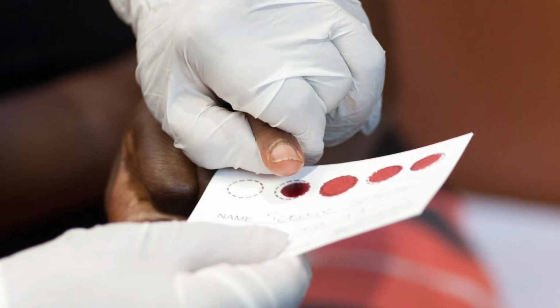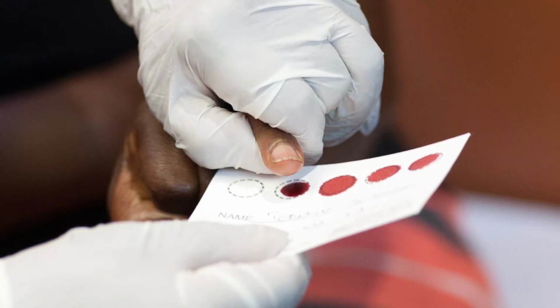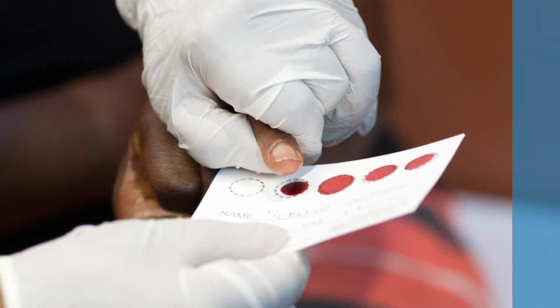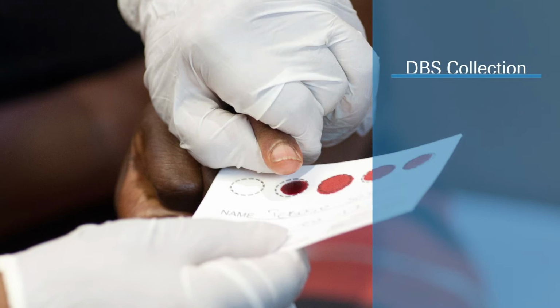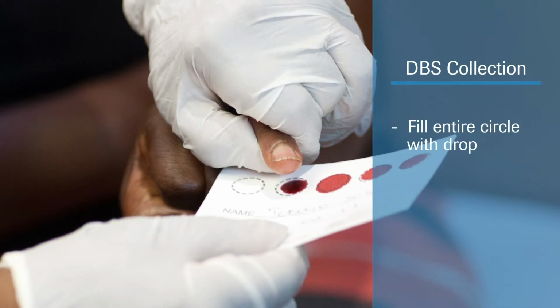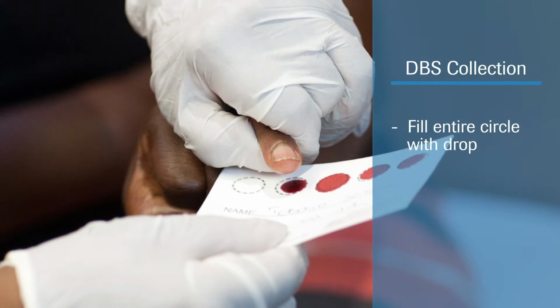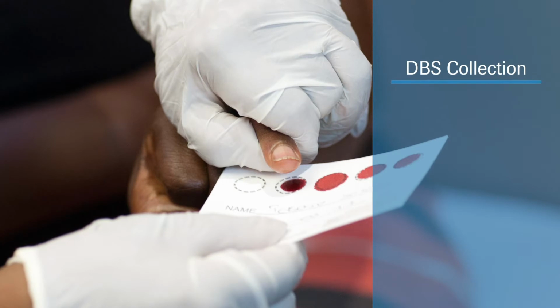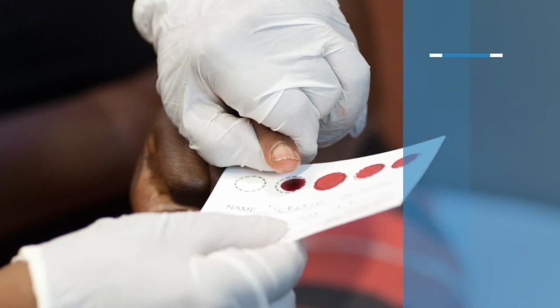Do not go back and layer another drop on top of a spot which is already drying. Do not squeeze or milk the finger to get additional blood. If you squeeze the finger, tissue fluid may come out together with the blood, and this can cause the result to be inaccurate.